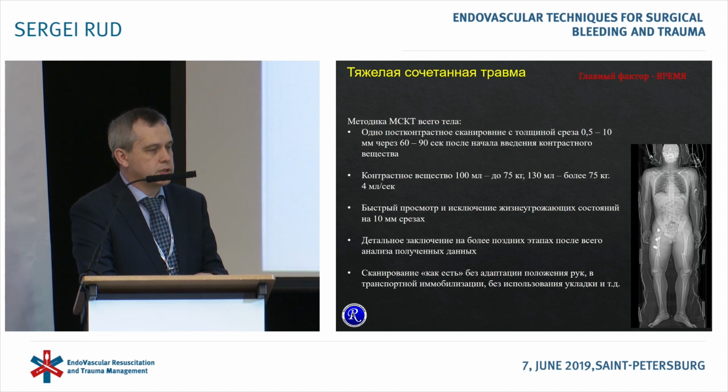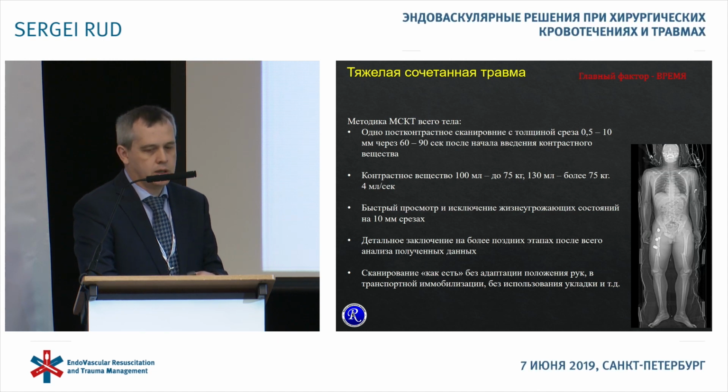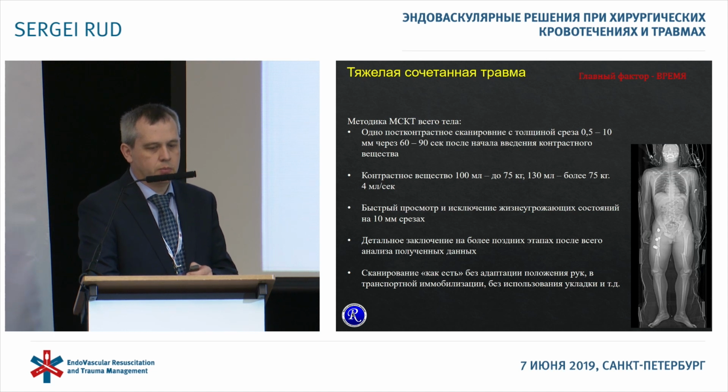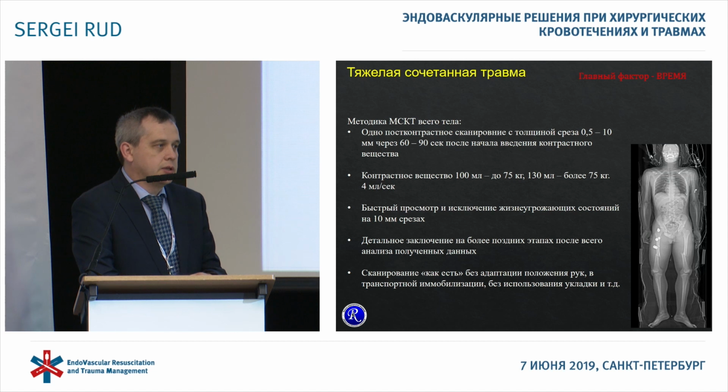Sometimes with the additional studies we check whether the patients are allergic to contrast or not. And also taking into account the weight of the patient, 100 ml if the patient weighs up to 75 kilos, and 130 ml if more than 75.